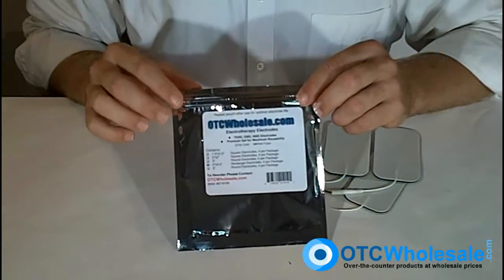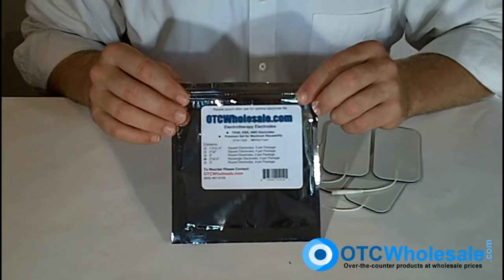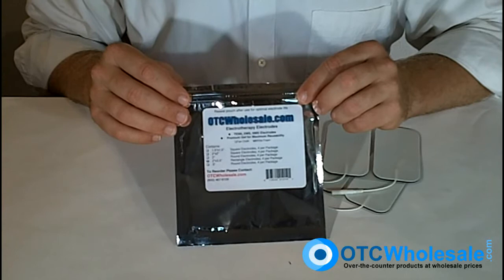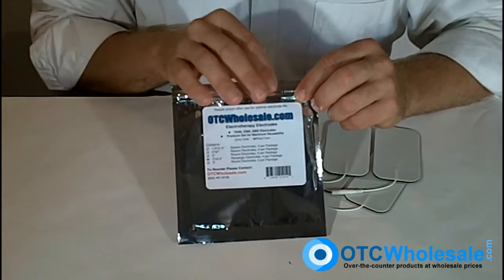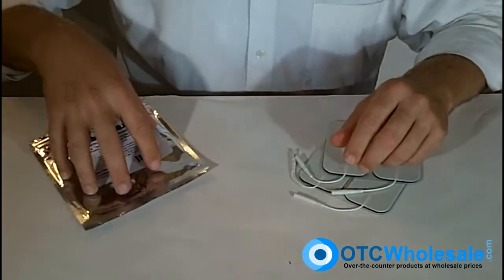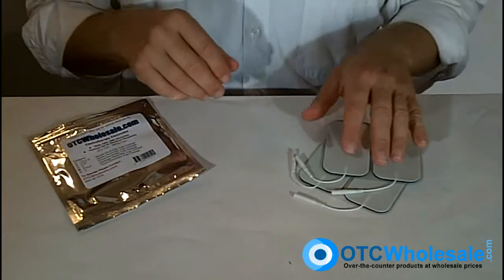Thank you for taking a look at OTC Wholesale brand electrodes. We take great pride in which electrodes we put our name on. This particular set are the 2 inch by 3.5 inch rectangular electrodes — a carbon electrode with a white foam backing. They arrive in a Mylar packaging that you cut the top off of, and then there's a ziplock closure so you can store the electrodes between uses and keep them hydrated. Hang on to that packaging.